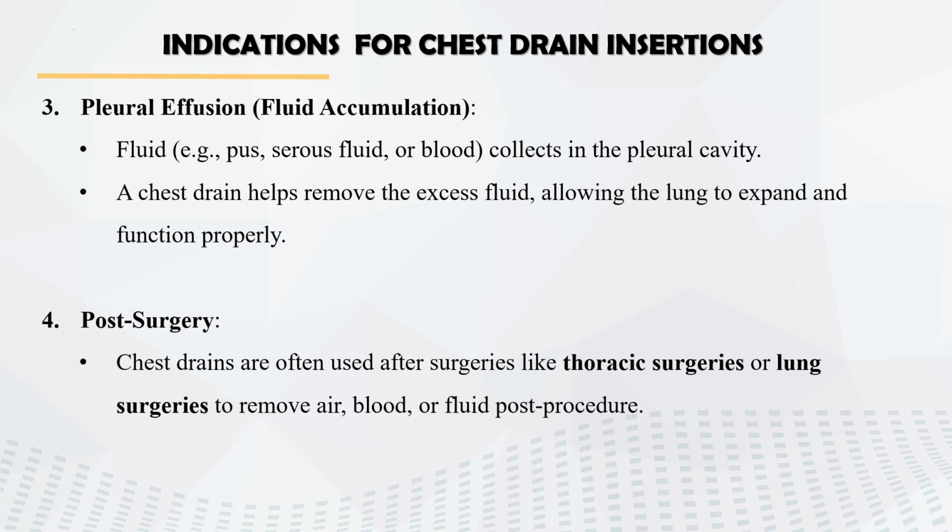Lastly on our list are patients who have undergone surgical operation. Chest drains are often used after surgeries like thoracic surgeries or lung surgery to remove air, blood, or fluid post procedure. So after the procedure has been carried out, there could be accumulation of air in the thoracic cavity, and it has to be drained using an underwater seal drainage.